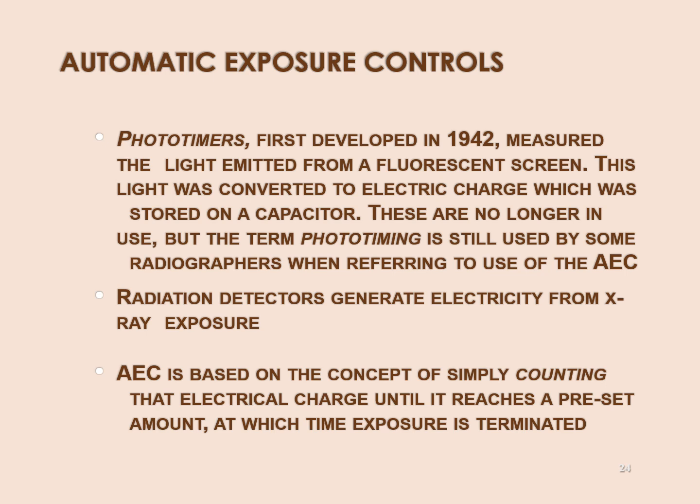And I think I'll go into that in just a little minute. So phototimer, see, 1942 technology. We've come a long way since that.